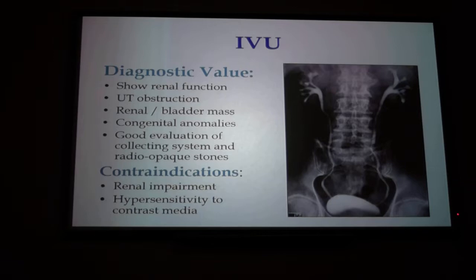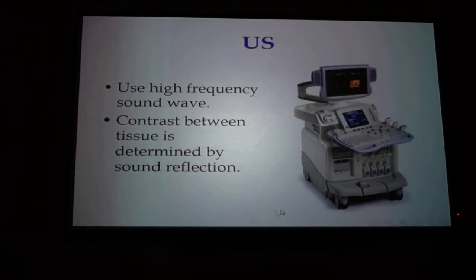These days we are using non-ionic contrast. Does anyone know what is non-ionic? That's a name, but what is non-ionic? Why do we use non-ionic? Does anyone know?